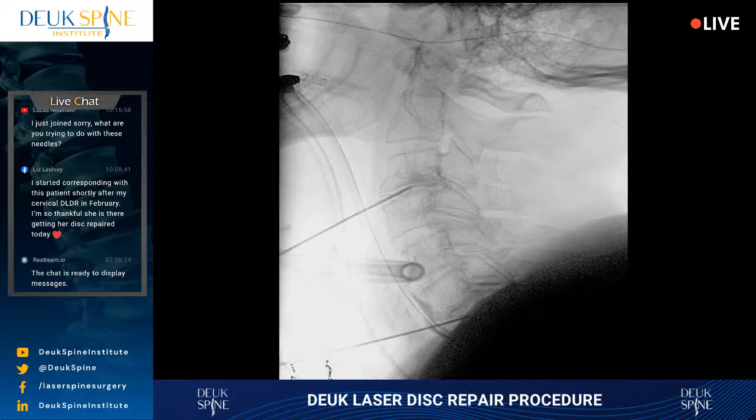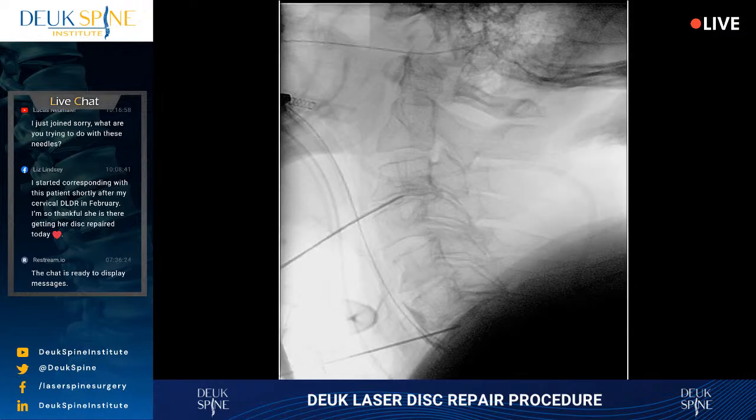and then we're going to remove the needle. Give me a slight pull, Luis, on the shoulder, and give me some inline traction, please, doctor. Well, hold on. Don't pull yet till she gets the head. Otherwise, you're just pulling everything south. You got to let her pull the head north a little bit. You ready? Okay. Yeah, just a little bit. Shot. Yeah, that's perfect. That's all we need.